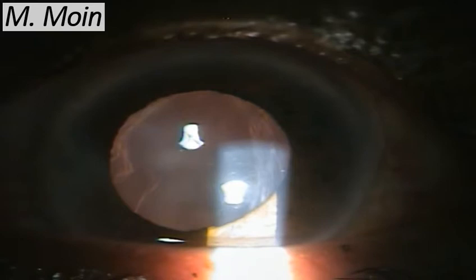So let's go forward, and this is definitely an arcus senilis, which you can see on the periphery. And on the nasal side, there's some bit of atrophic pterygium, or it looks like something in that category. So let's go forward and look at the red reflex examination.